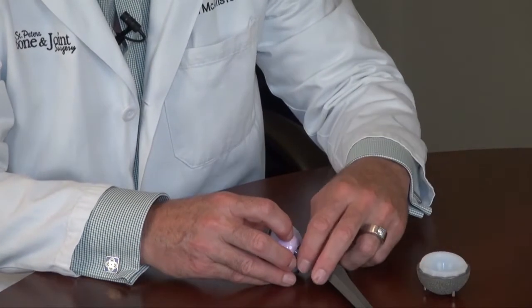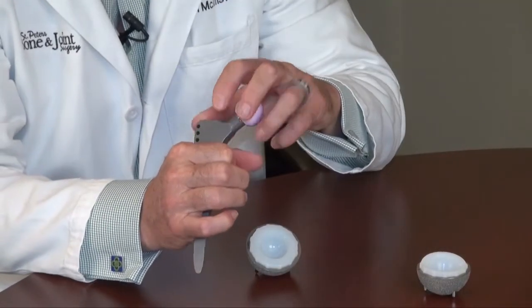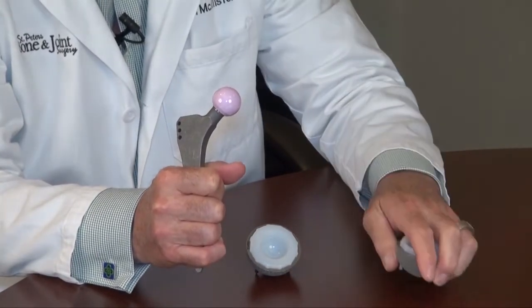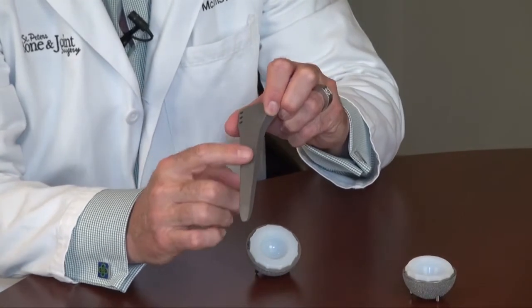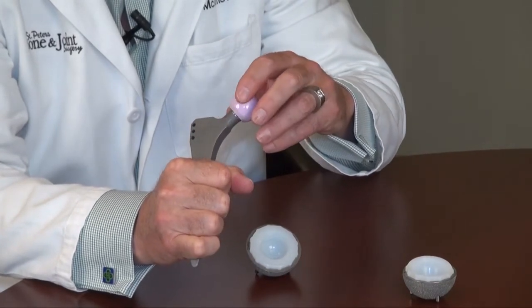There's a stem that goes down inside the femur, down the hollow part of the bone, and these come in all different sizes, and so do the sockets. They go up every 2 millimeters in size, so we can get the size that fits very nicely and very tight. It goes down inside the bone and locks in, and the bone will grow into this titanium and bond to it to make this a firm, tight fit.